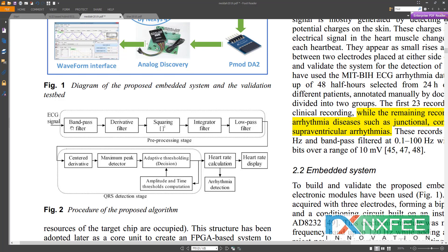The bandpass filter is designed using an eighth-order filter, which combines a high-pass filter and a low-pass filter. The derivative filter reduces noise by comparing the current signal with the previous two samples. The squaring step improves the power level of the ECG signal to better reveal ECG patterns. The integrator filters high-frequency noise, and the result is passed through a low-pass filter, then to the center derivative maximum peak detector and adaptive thresholding.